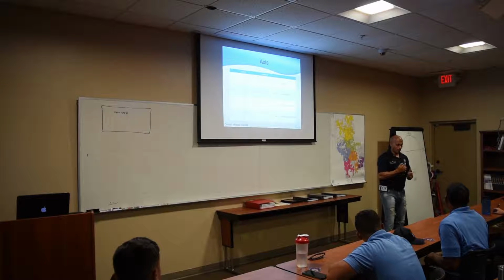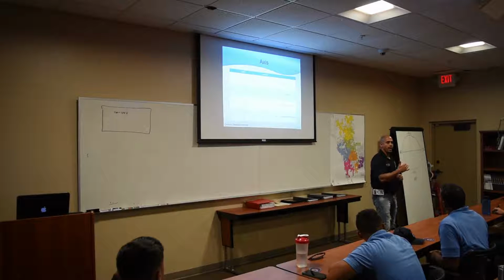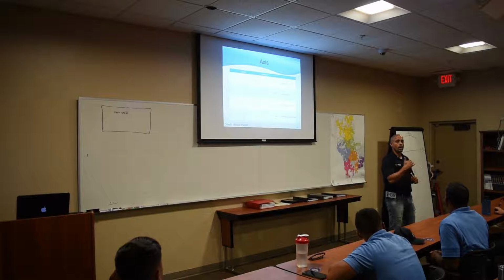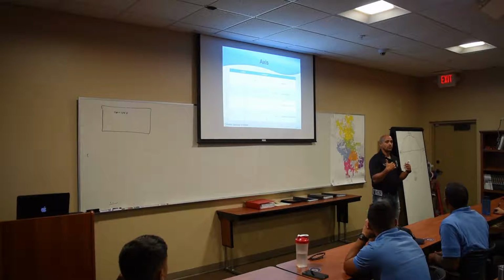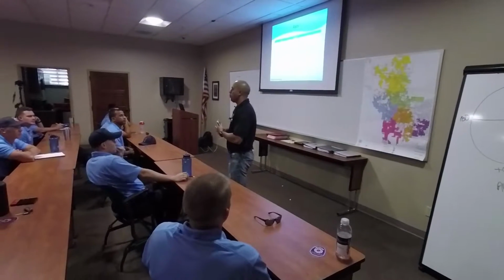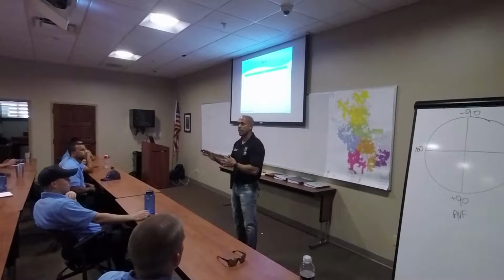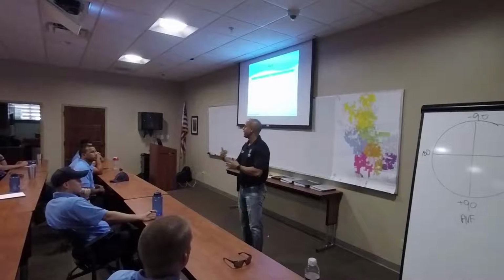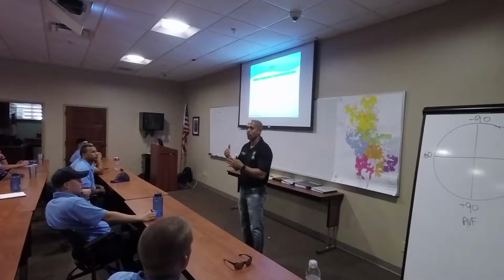All right? Now, I'm going to tell you what creates left axis deviation. When you have that, what could it be? Right axis, what could it be? One thing you can see, when you have an MI patient, a patient who's having an MI that's evolving, and I start to treat them, we always question, is our medication treatment working? Well, if I'm ischemic, guess what electricity is going to start to do? Deviate, right? But if I start to perfuse, then guess what electricity will start to do again? Back to the vectors will start going directly.